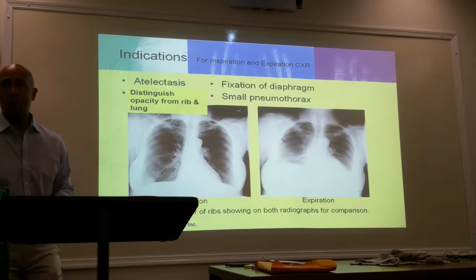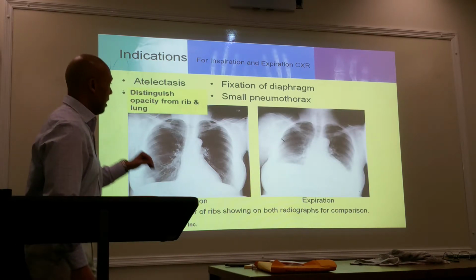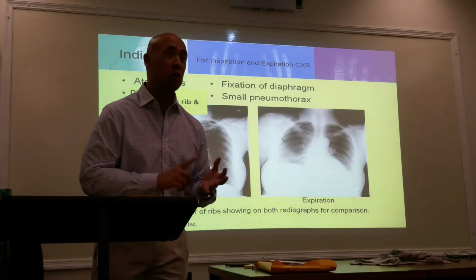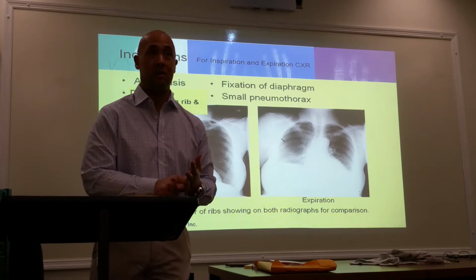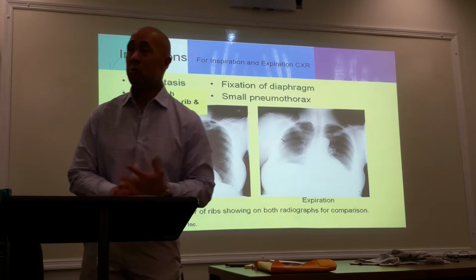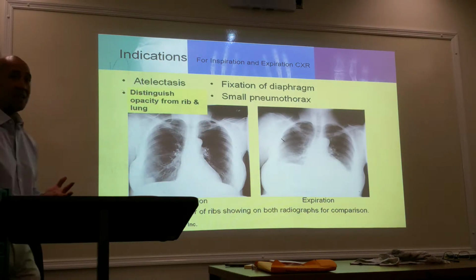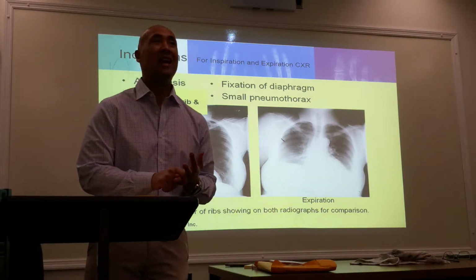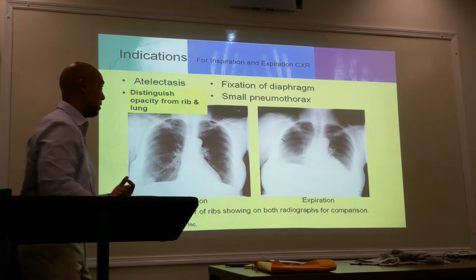So this slide here is based on, again, we do full inspiration breaths, but there are some instances where you will do both an inspiration and an expiration breath. It is done for comparison. When would we do an inspiration and expiration? Well, we would do it for atelectasis. What's atelectasis? Collapsed lung. So we're going to do a comparison with inspiration versus expiration.